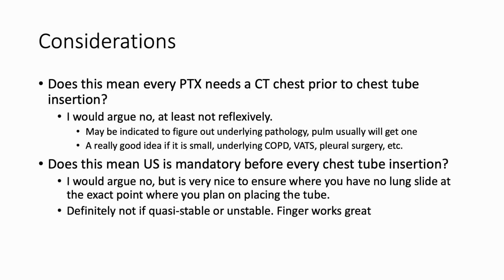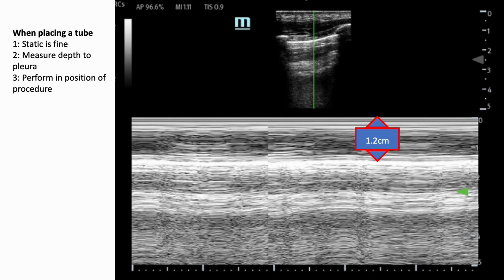And so obviously anybody who's unstable or quasi-stable is not really a great candidate to wait. Obviously, if you've got the ultrasound there, it's a 30-second delay in putting the tube in to just look once with an ultrasound. So I don't think it's a bad idea to do, but I wouldn't say it's necessarily standard of care or mandatory.